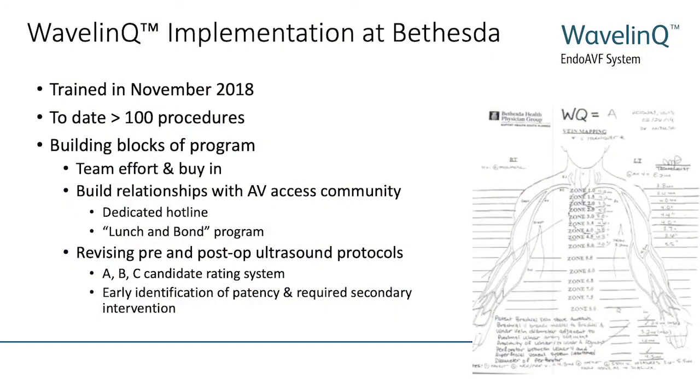We're in a community hospital. We took one of our standard operating rooms. We upgraded our imaging system to an oversized flat panel, but we still do them under C-arm. Our technical support is our endovascular operating room staff. Thankfully, they became very excited about this technique, so everybody bought into it and wanted to be part of the team.